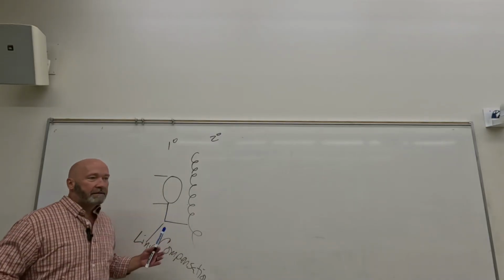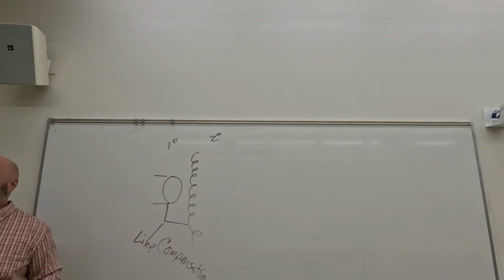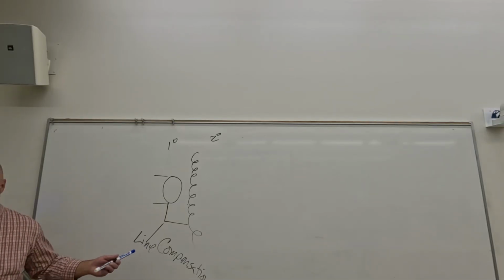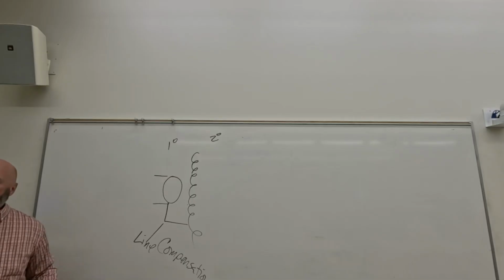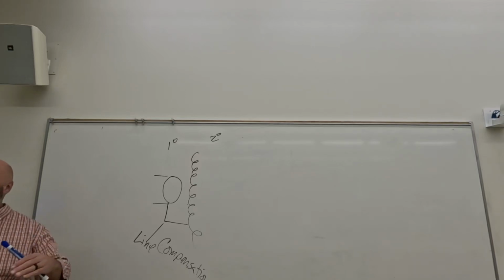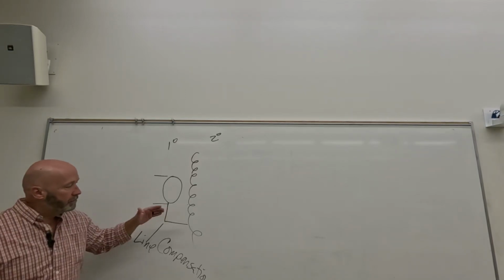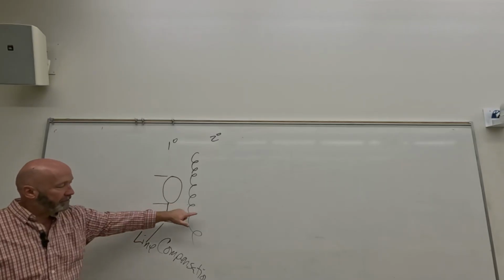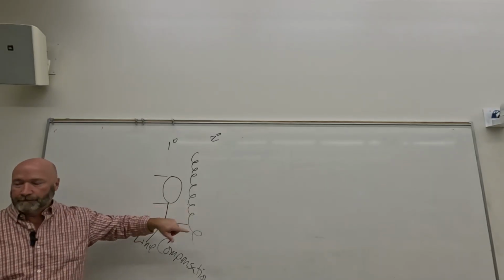A constant battery backup supply is more like what this is, but it doesn't work off batteries as far as I know. What it does is protect against spikes and valleys. So it's a surge protector, but it's also a constant supply. It knows how to adjust to give us the right amount of voltage before we get into the auto transformer.